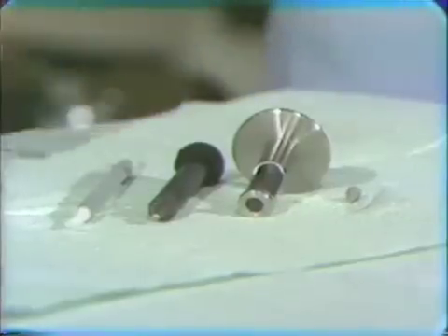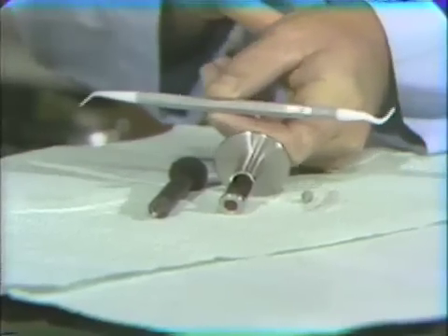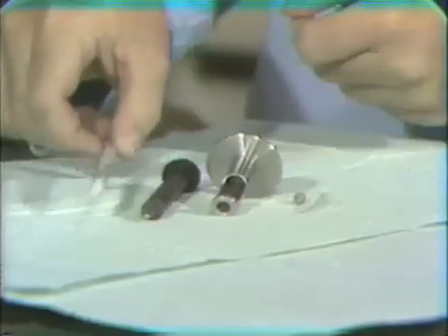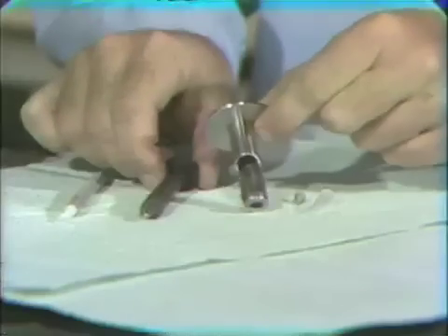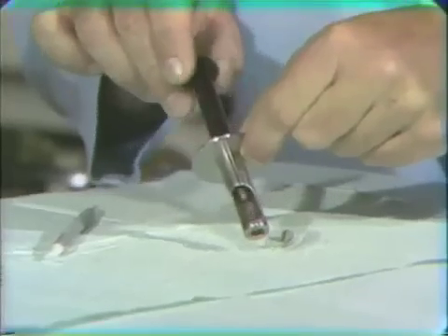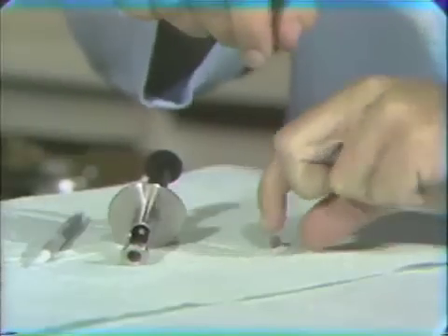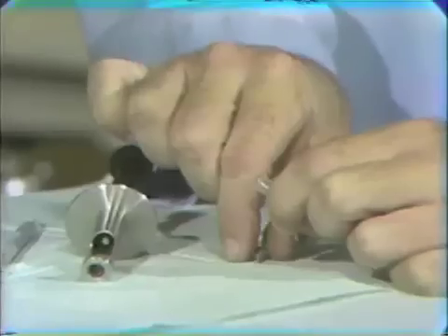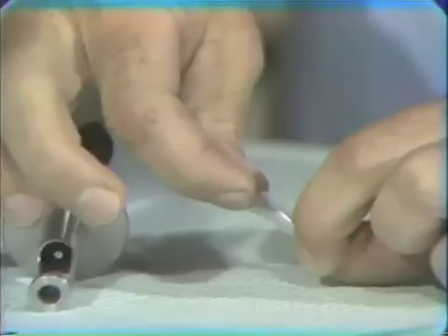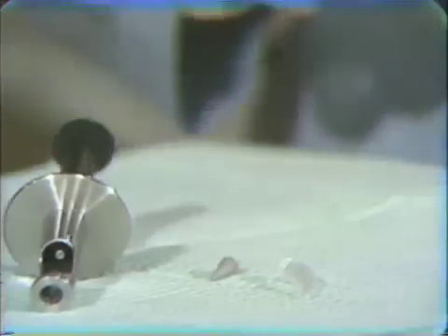In the manipulation of the materials, and placement especially, we'll be using a Premier Teflon instrument. It is a flat-bladed instrument on both ends, and it is used to burnish the material into place. Then we have a carrier for the composite itself. It consists of a barrel and a plunger, and then it has a disposable plastic tip which has its own little plunger to go into it. This plastic tip will be filled with material, the plunger tip placed in it such as you're seeing here, and then that will be placed into the syringe.